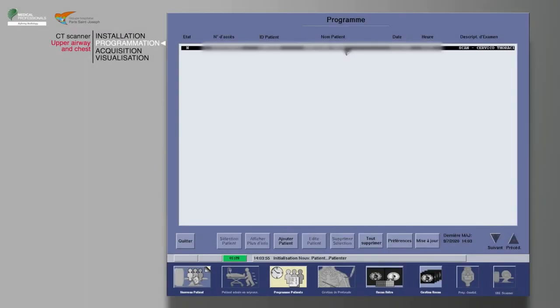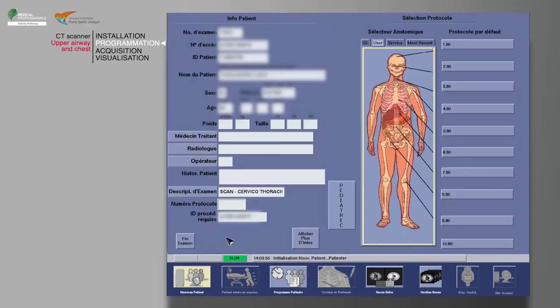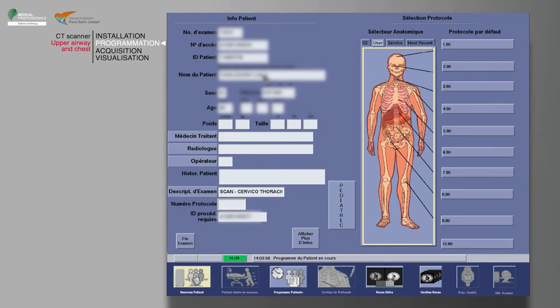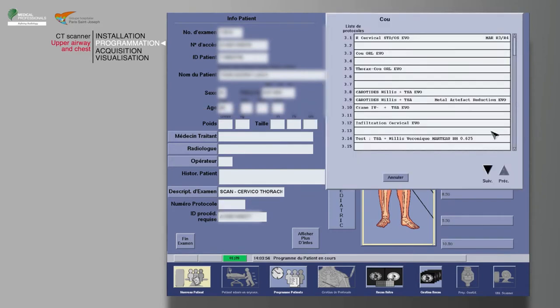Select your patient from the work list, then click on patient selection. Verify that the pre-filled information is correct and fill in the patient's height and weight. Finally, choose the appropriate protocol.